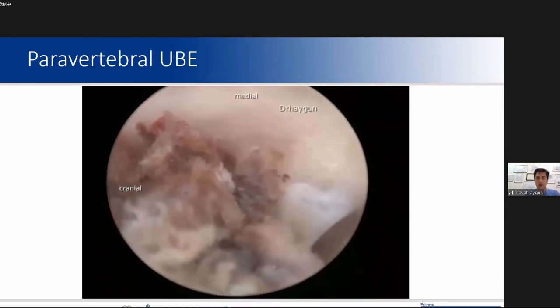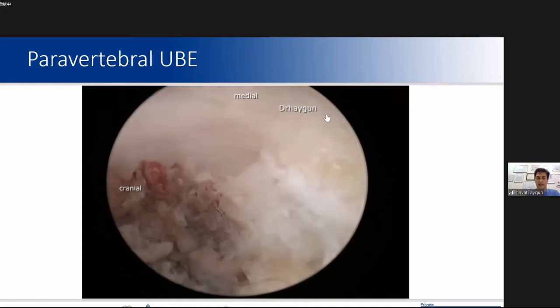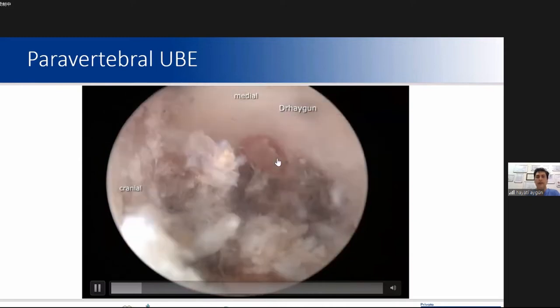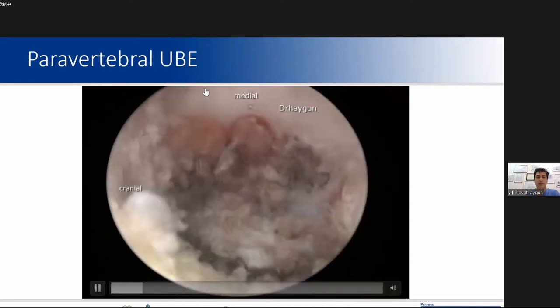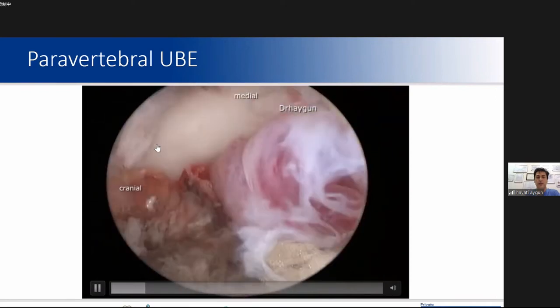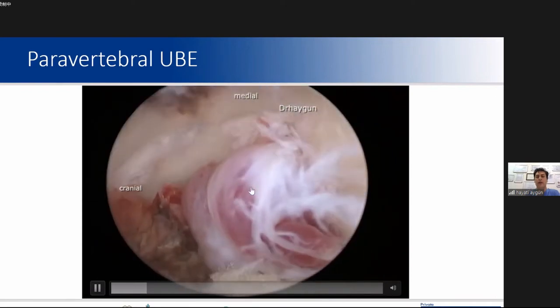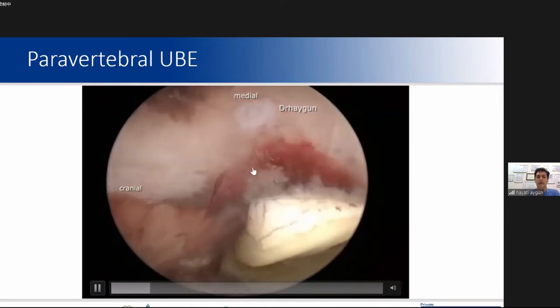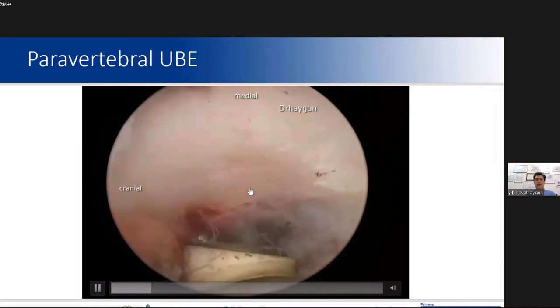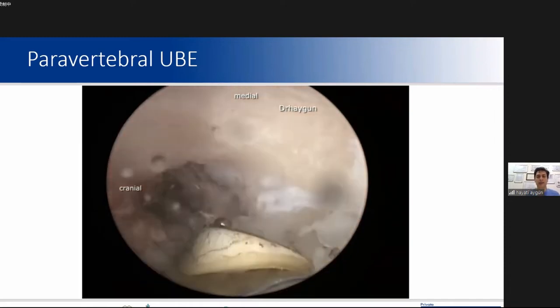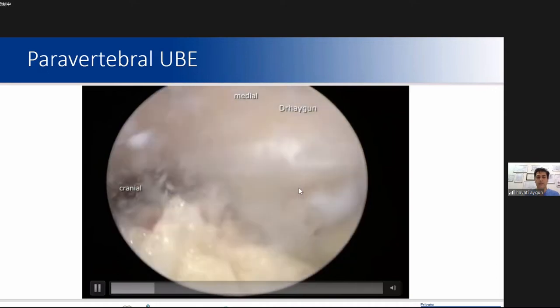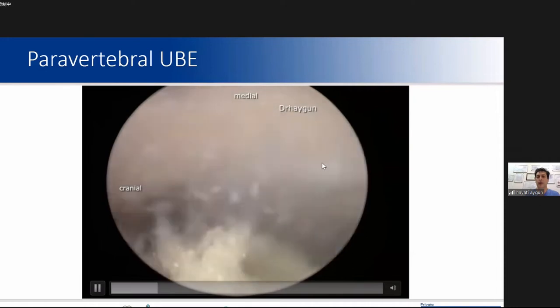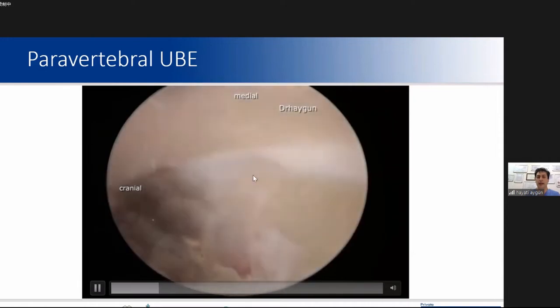We need to see the joint line. Here is the isthmus. You can see the facet joint and the synovium. The hypertrophic synovium can be seen clearly. Then the joint line is identified, and shaving is performed.